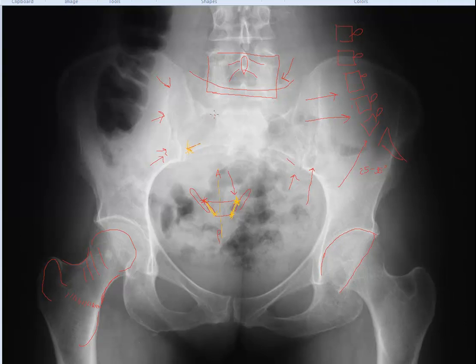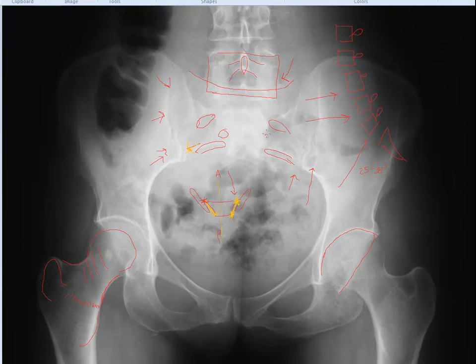Here are some sacral foramina — notice that these are almond-shaped. These represent anterior sacral foramina. Here's one example of a posterior sacral foramen, which is more circular and pea-shaped. This whole region is considered the pelvic inlet, and you should have a nice smooth curvilinear margin to this region.